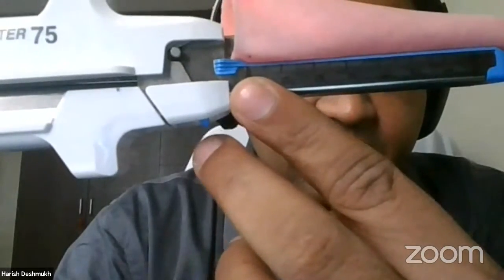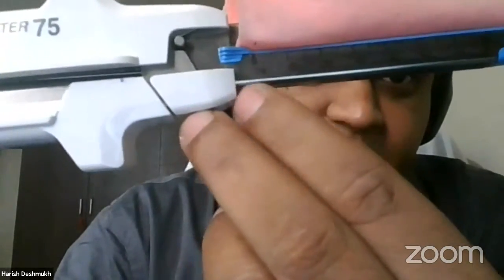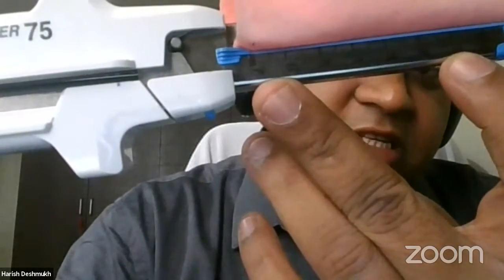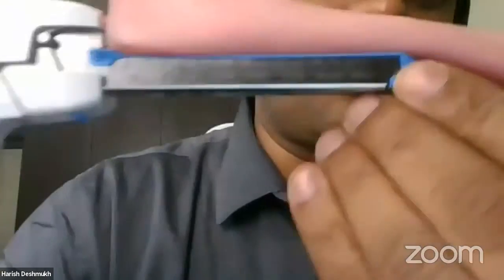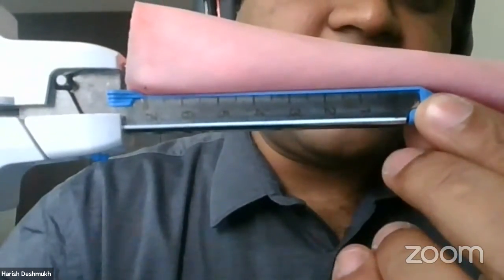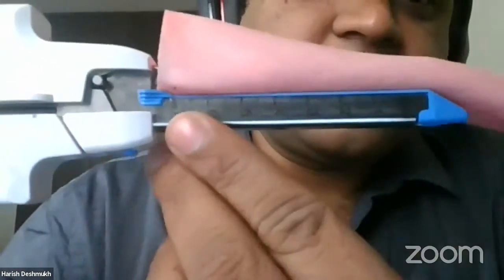This gives you a very clear indication of where the staple line starts. You can see an arrow mark here and another arrow mark here. These two arrow marks show that the staple line is there. The arrow marks are exclusive to the staples. There is an end mark for the staples, that is the distal end, and this is the proximal end. This is what the staple line will be.